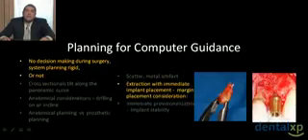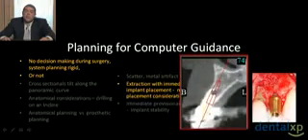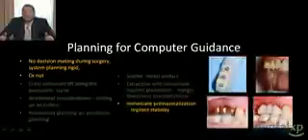Or it may be that we're dealing with a case such as an extraction and immediate implant placement, right? And where's our difficulty there? Well, where exactly is the cervical position of that implant going to be? When we look at the density of the bone, cortical bone, that overlies that root, because that bone is very thin, we can't always identify exactly where the bone ends, right, and where that tooth begins. And so we may be able to plan for our location and angle and general depth, but the final decision-making of exactly where the cervical position or portion of that tooth needs to be done at the time of surgery.